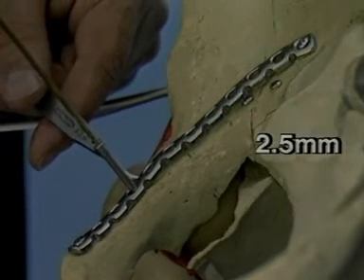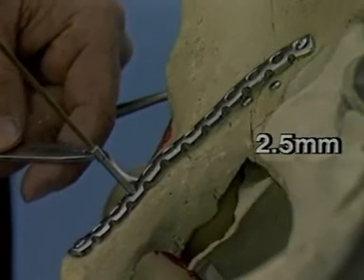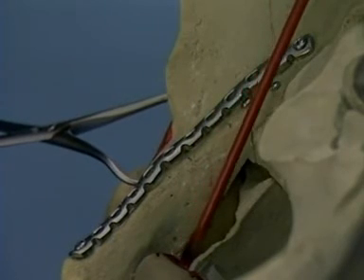When holes are drilled through the lateral portion of the superior pubic ramus and the obturator canal entered, too deep penetration can injure the obturator nerve. The red pointer shows the position of the obturator nerve.